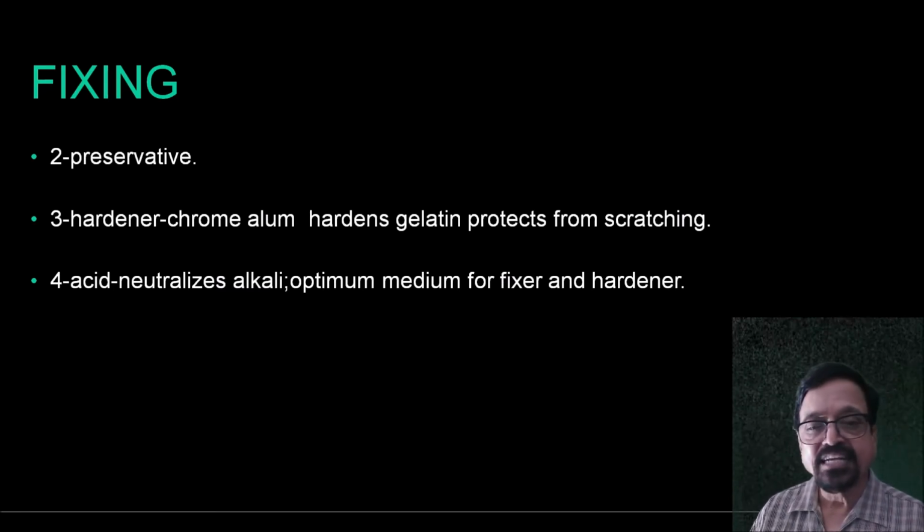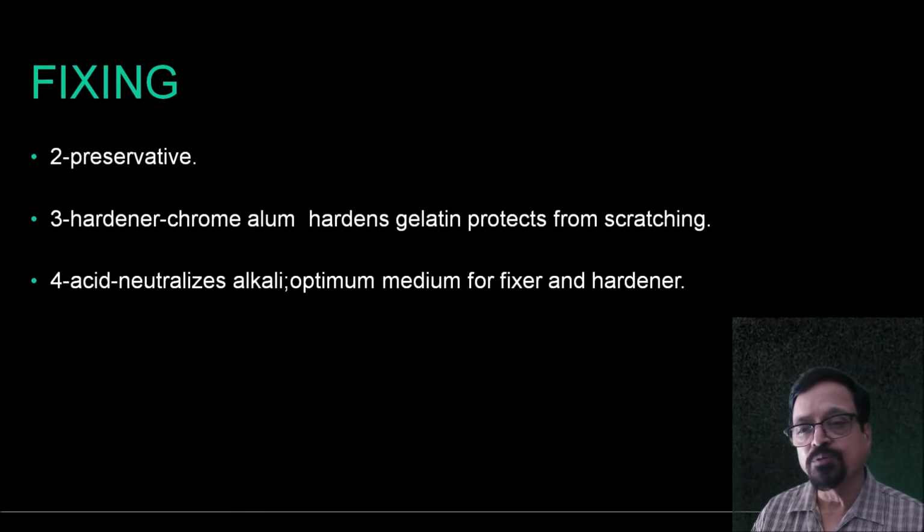Then the acid neutralizes alkalis. That is the optimum medium for fixer and hardener. So this is another basic principle behind all this processing.